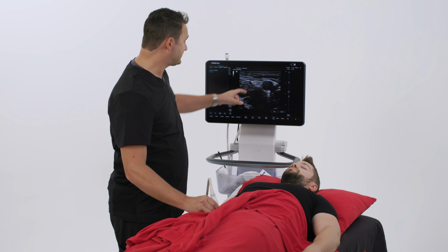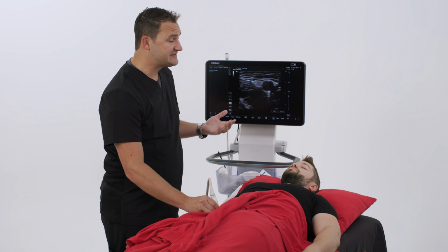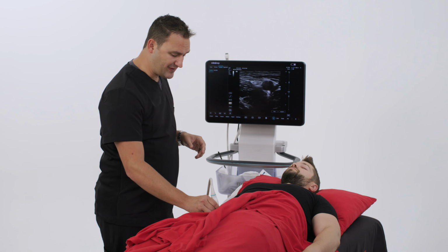You can certainly blast this nerve away with 30 cc's of local anesthetic, but you certainly don't need to. 10 cc's of local anesthetic is plenty enough to get an effective femoral nerve block. Moving on to a fascia iliaca.